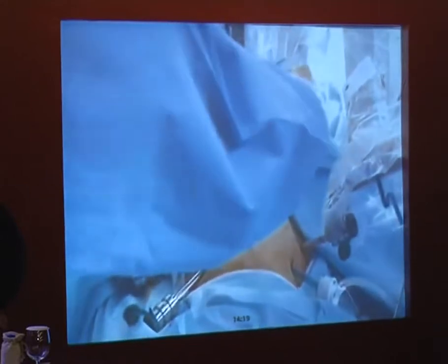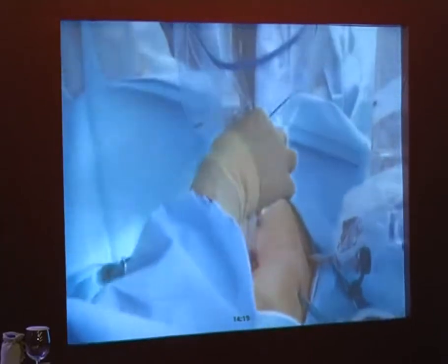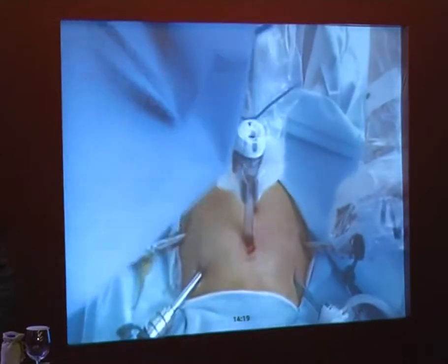So we just docked the camera. We're going to go ahead and bring in arm two. You can see that here. This is arm two. Again, we're going to fold this arm inward so that we can gain some maneuverability here. And then the last arm to bring in is arm three.